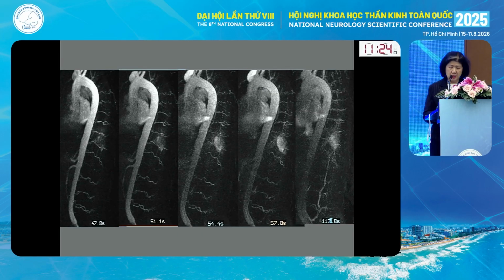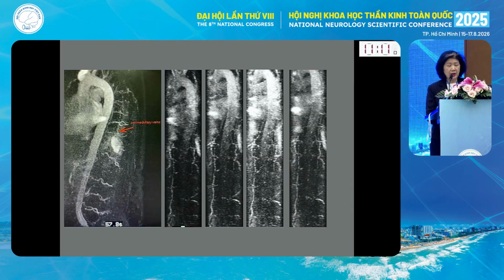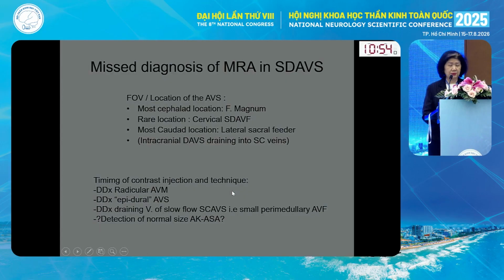In some cases, you have a hard time to see. You know that there are some abnormal veins located there. But what about the shunt? So if you look carefully and you do this, finally you detect at this level, at least at this level. So your catheter will be hooked into that level, and try to see down from that whether you can find the shunt lower down.